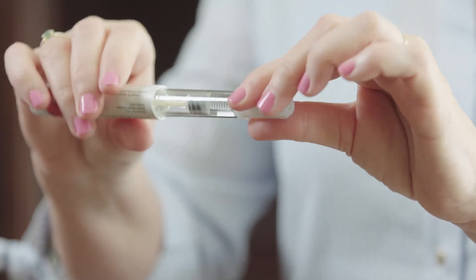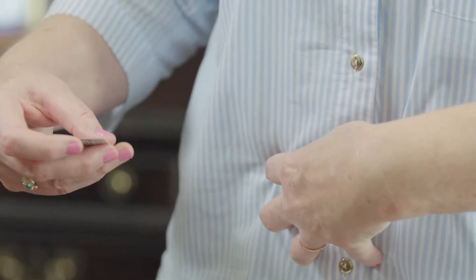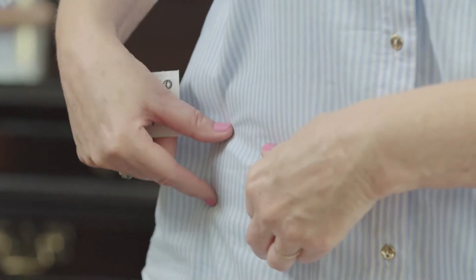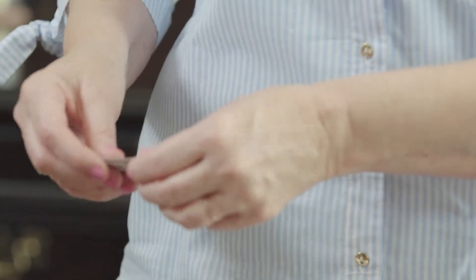Pull the large cap off, and there's a small sheath over your needle. You'll set your pen down to prepare your injection site. The site is going to be your abdomen. You want to stay at least an inch away from your belly button, but anywhere in the outer part of your abdomen you can inject the medication. You will take another alcohol swab, clean the tissue, and allow the alcohol to dry.